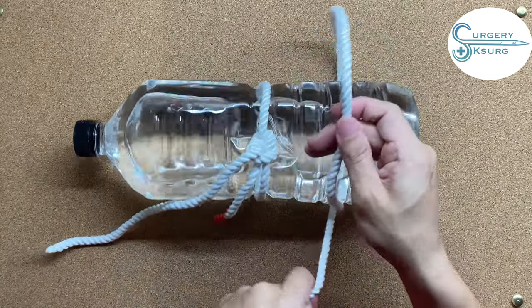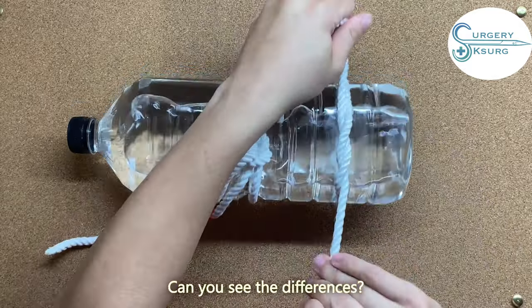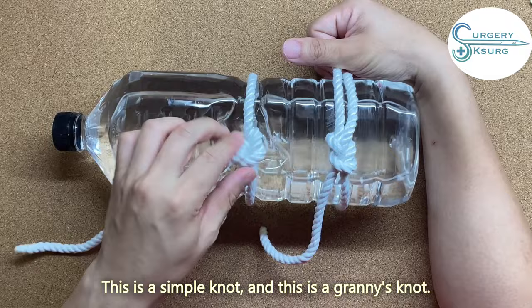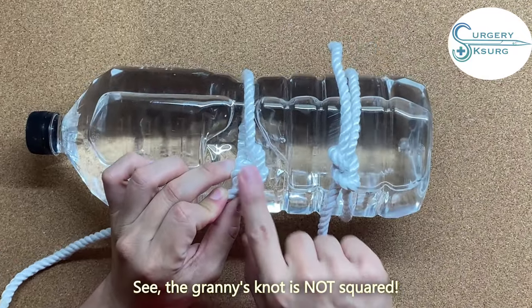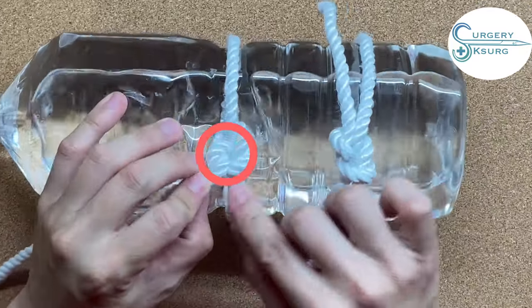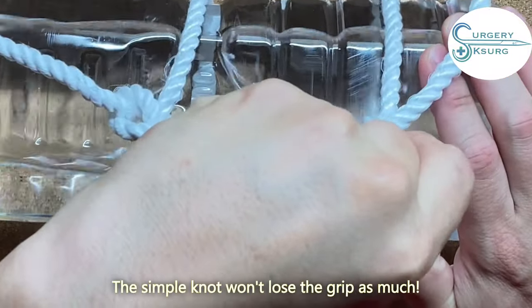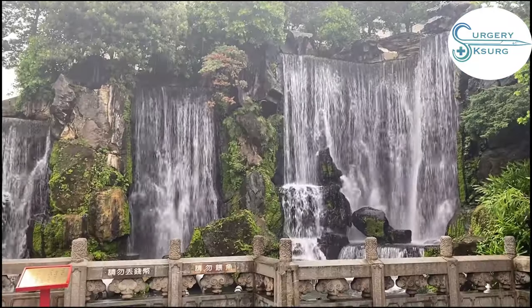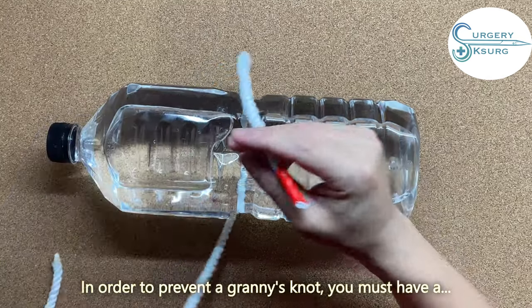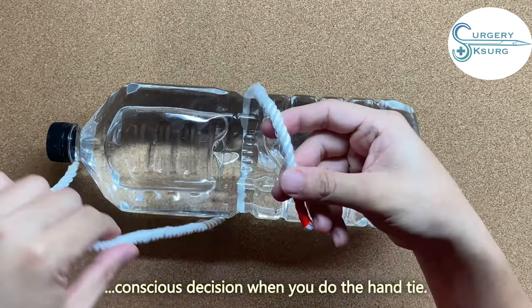Let me show you the proper simple knot. Can you see the difference? This is a simple knot and this is a granny knot. The granny knot is not square — just look: the simple knot is square, the granny knot is not square, and it loses its grip. A simple knot won't lose grip as much. To prevent a granny knot, you must make a conscious decision when you do the hand-tie.